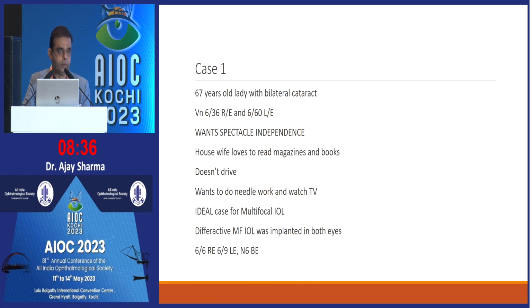You have to tell in counseling, that is very important, but the patient also demands something: he wants spectacle independence. Housewife, loves to read magazines, doesn't drive. Again, very important, because you need to know whether halos or glare will be there, and she wants to do near work and watch TV. This is the ideal case for a multifocal lens.